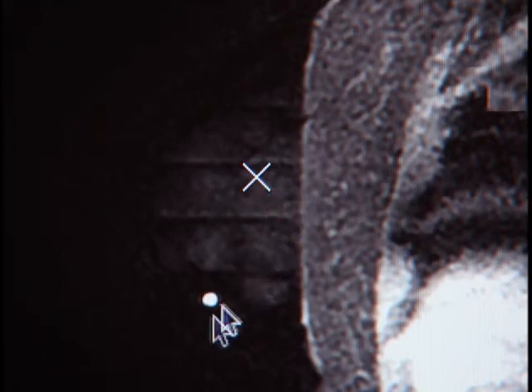So in summary, place your fiducial, find the fiducial, navigate to the lesion, make sure your lesion is accessible, find the depth of the skin surface at the block where your lesion is located, and subtract that from the slice depth of your lesion. Be sure to add to it any depth for an introduction block if you're using one, and then record the relative position of your introduction relative to the fiducial marker.